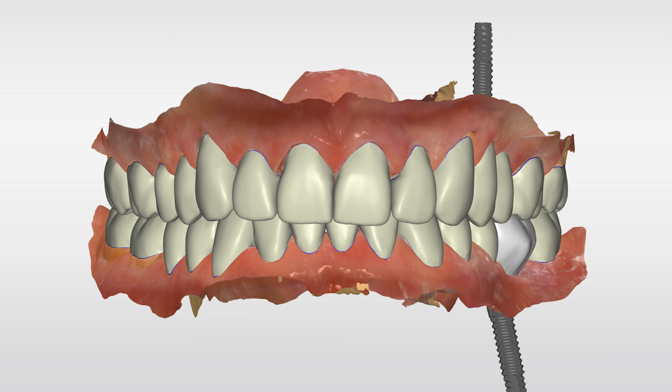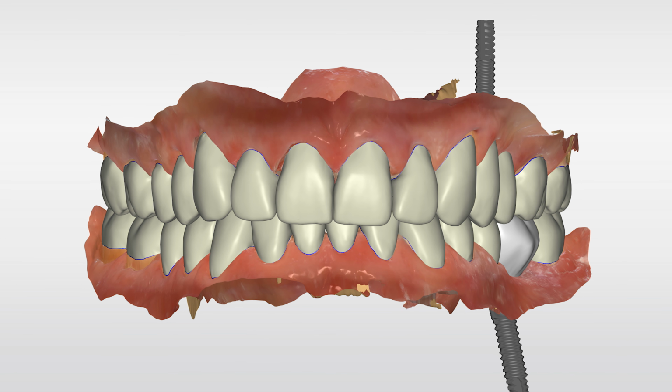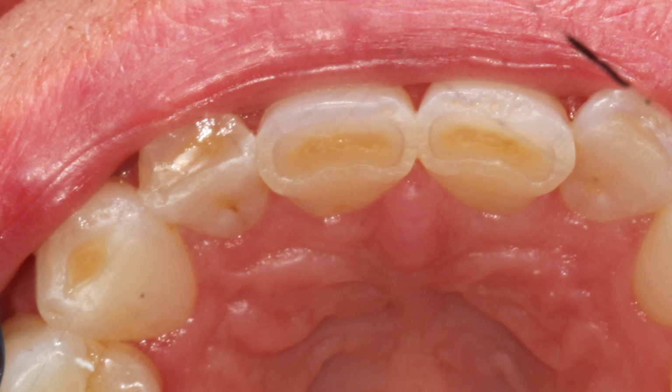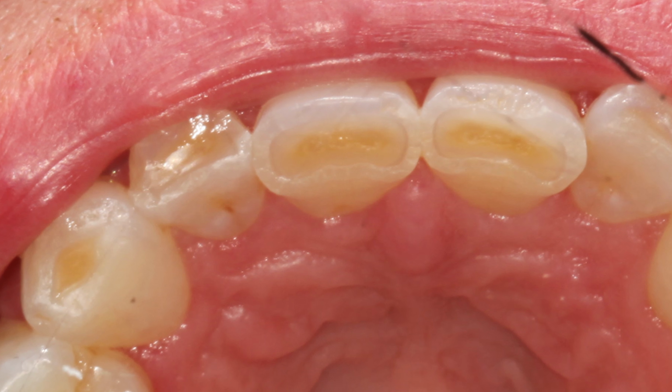For this gentleman though, we decided to go ahead and do the full thing. We did upper and lower teeth. We did veneers on the front ones and some crowns on the back. The crowns have to cover the top surface of the teeth so that way they actually increase the height of the teeth. The last thing we want to do is take somebody who has tons of wear, which, keep in mind, means that they've worn through the enamel, they've worn through the dentin, and now they're getting really close to the nerve. The last thing we want to do is prepare the tooth with another millimeter of reduction and drill right into the nerve or make the tooth extra sensitive, make more root canals.